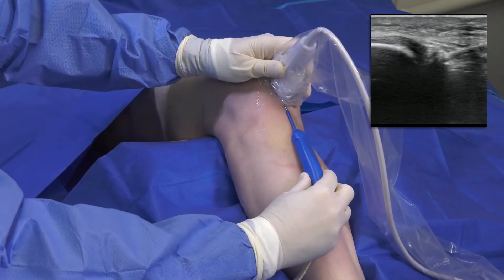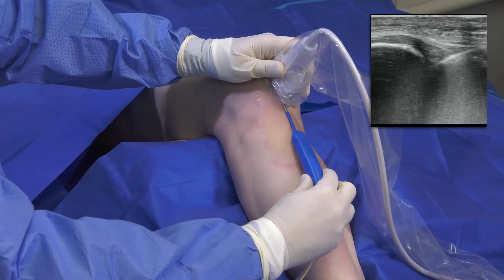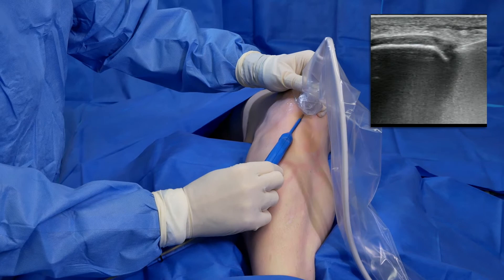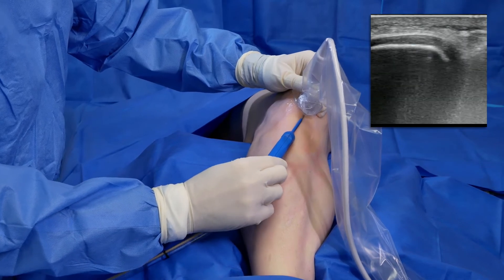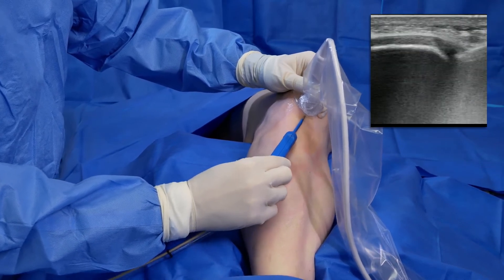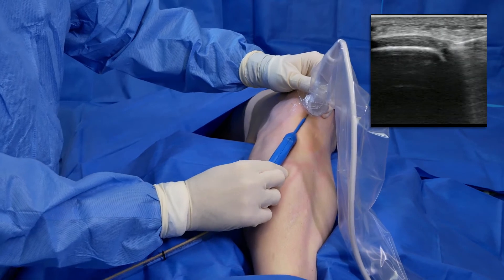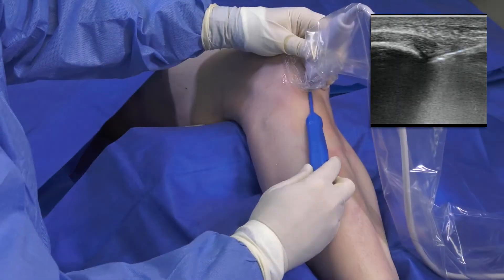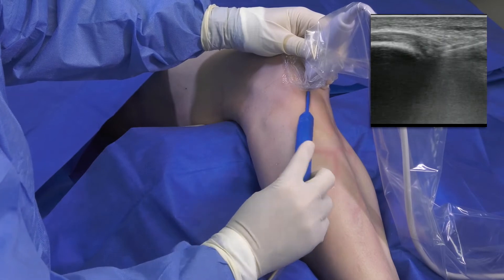As you can see on ultrasound, the TenJet device is angling downwards towards the diseased tissue. Once the TenJet needle is in place, I depress the foot pedal to start debriding the diseased tissue from the site. On ultrasound the TenJet tip is very visible. I move the needle in a gentle pistoning motion forward and backwards, or rotate the device, to reach all the pathologic tissue.